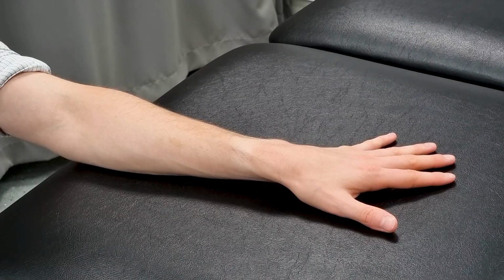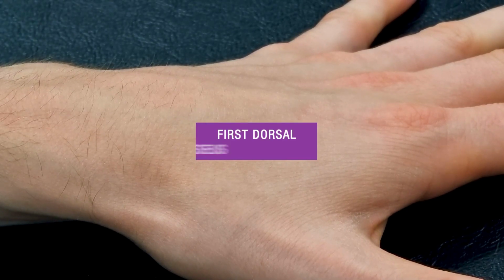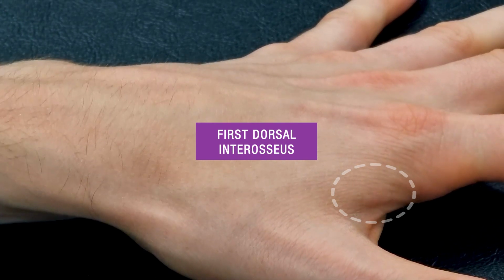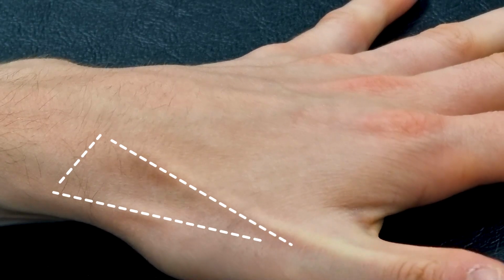We have now turned the hand over so that we can look at surface anatomy of the dorsal surface. We will pay particular attention to the anatomical snuff box. The lumbricals and interosseous muscles are more difficult to palpate. However, with the first finger abducted, it is easy enough to palpate and visualise the first dorsal interosseous. Extend the thumb and identify the borders of the anatomical snuff box.